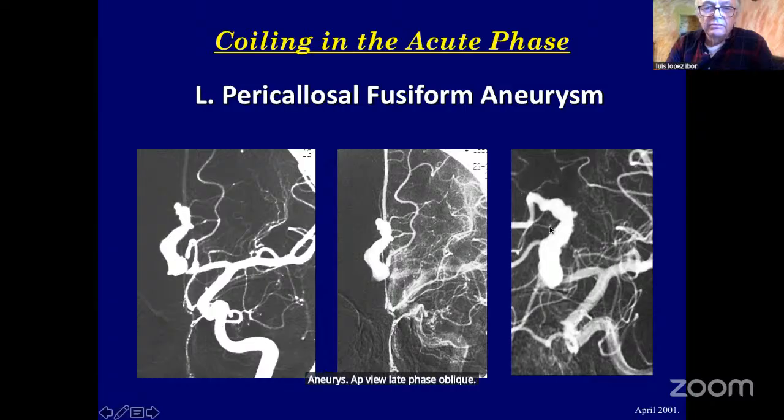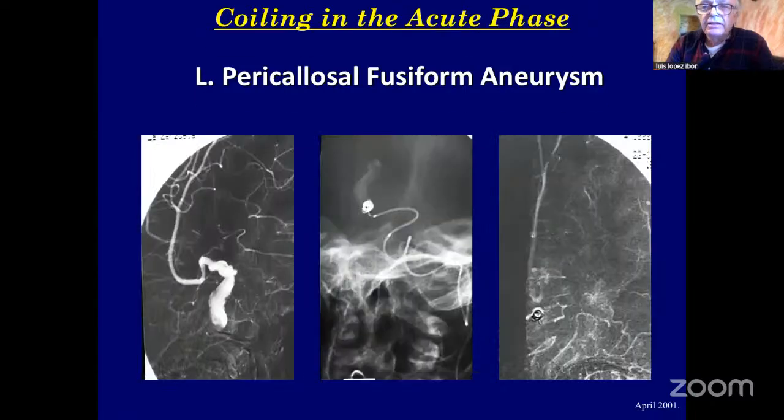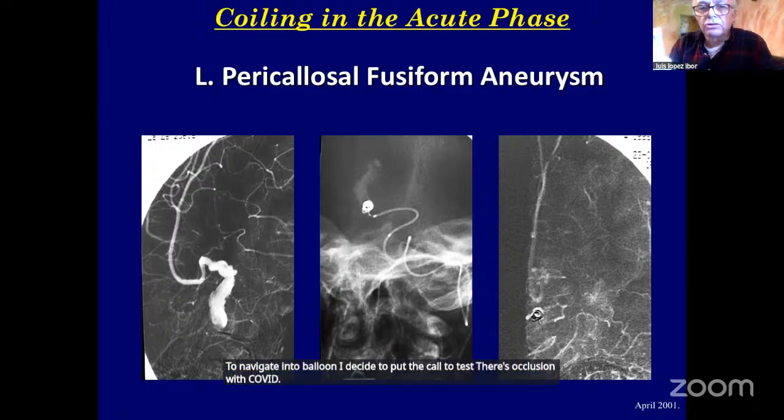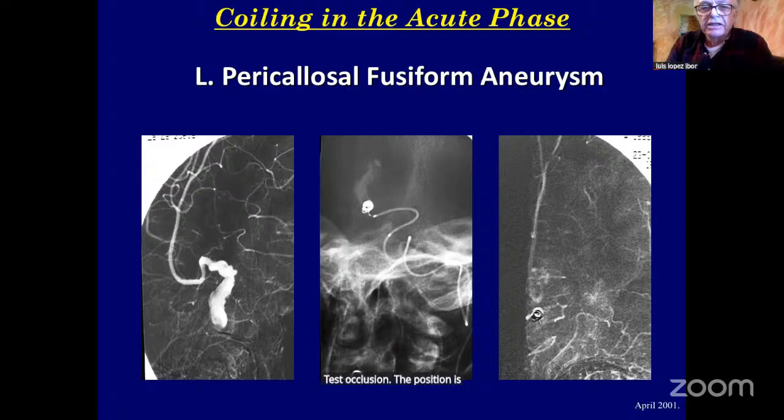Because it's impossible to navigate with the balloon, I decided to put in a coil to test occlusion with coil. The patient is under general anesthesia.